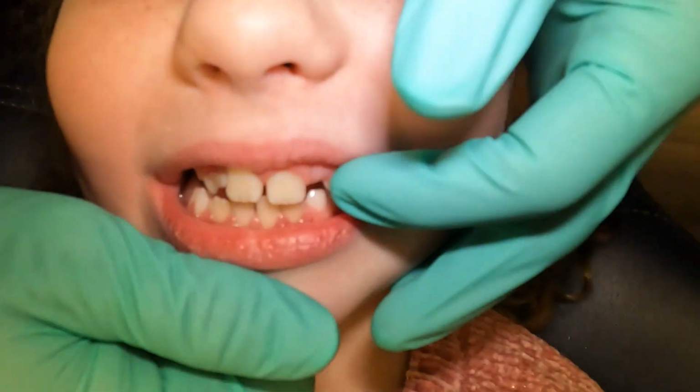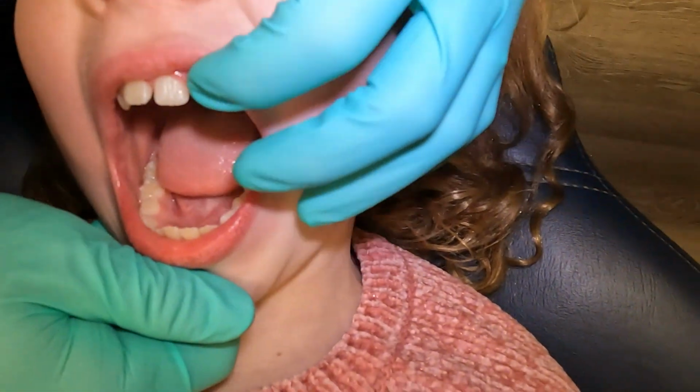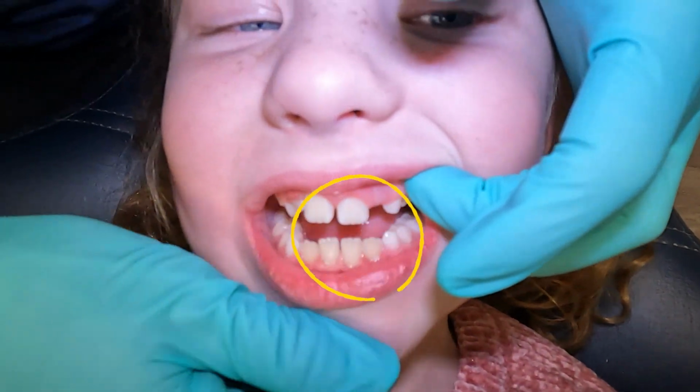All right, now when we open our mouth, open really wide, and then she's gonna show us, she's gonna bite down, try to bite. Oh, look at that.